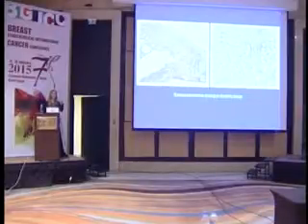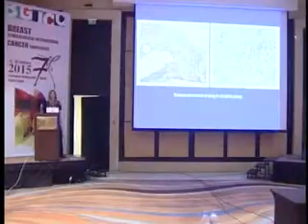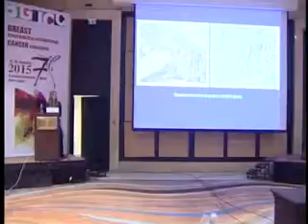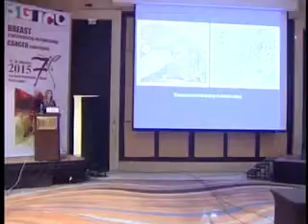We call it total submission. So literally, you go very thin. You don't have to go deep, the full section. No, we go superficial, but we submit the entire endometrial cavity. There was no tumor, literally. So, what would we call it? No residual tumor, you see.